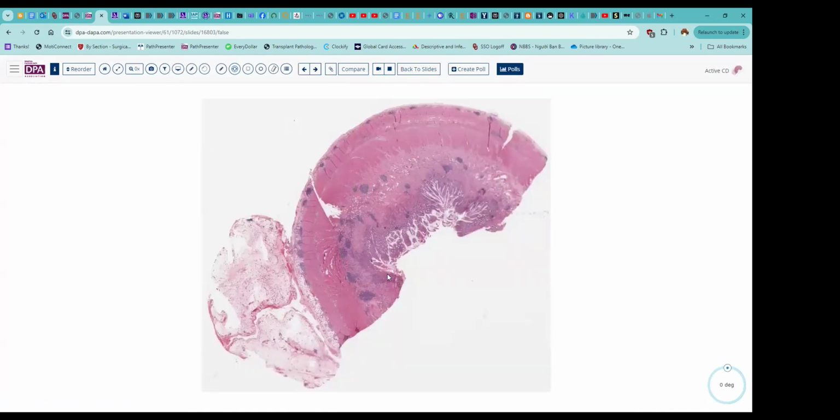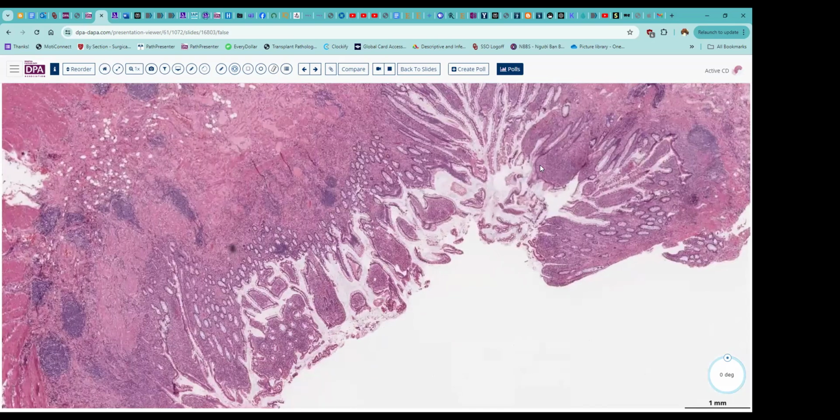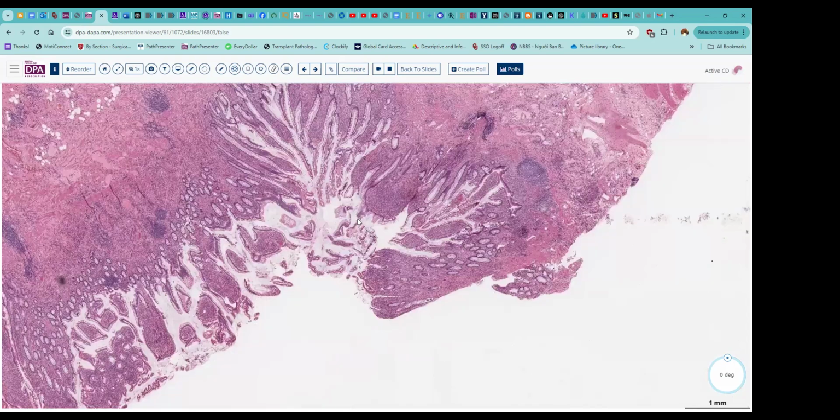Okay, well, here we'll move on to Crohn's disease. And again, we're in the small bowel. And I think you can see here at low magnification, quite prominent adventitial inflammation, deep submucosal inflammation, and then some evidence of surface distortion. It's not particularly great here.